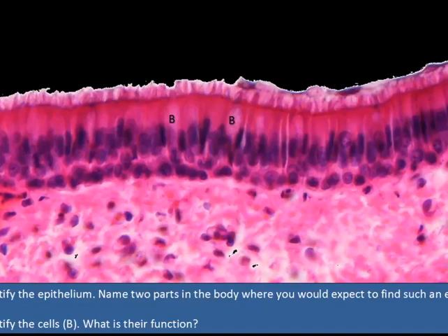This is a type of epithelium that, though comprising only a single layer of cells, has its cell nuclei positioned in a manner suggestive of stratified epithelia. So it is a pseudo-stratified epithelium. The term pseudo-stratified is derived from the appearance of this epithelium in section, which conveys the false.